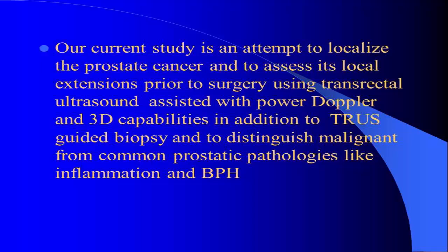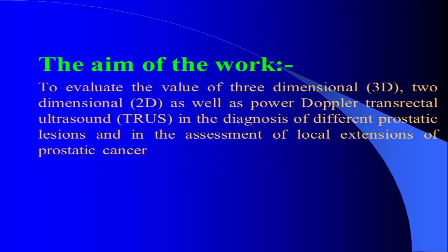So, every attempt should be made to assess the site and the extensions of prostate cancer before surgery or before management, using more sensitive predictors like the imaging modalities in our hands. The aim of our current study is to evaluate the value of three-dimensional, two-dimensional, as well as power Doppler transrectal ultrasound in the diagnosis of different prostatic lesions and in the assessment of local extensions of prostate cancer.